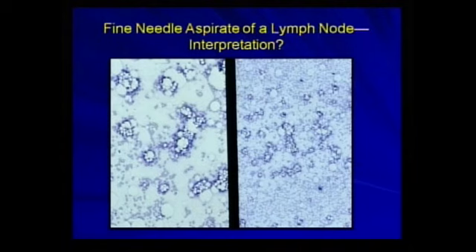I do not see intact adipocytes here. What I see is essentially cell fragments. The fat is there, the cells have been fragmented by going through the needle, and you end up with these very small vesicles. So this is aspiration of the fat.